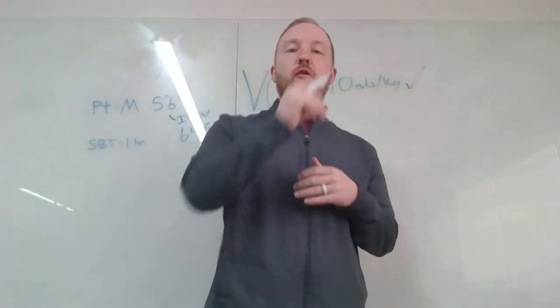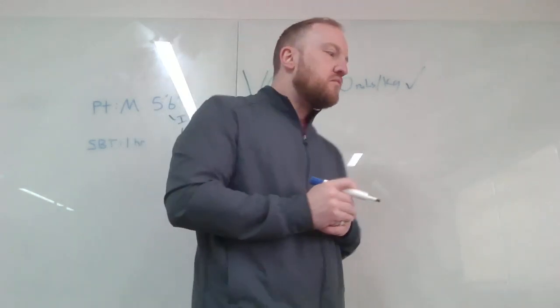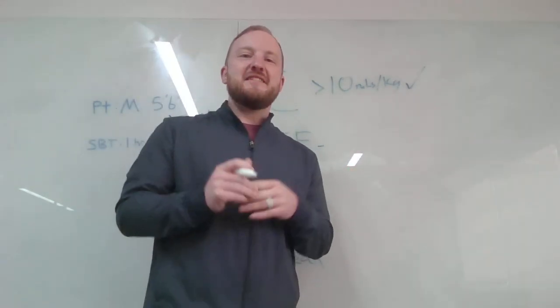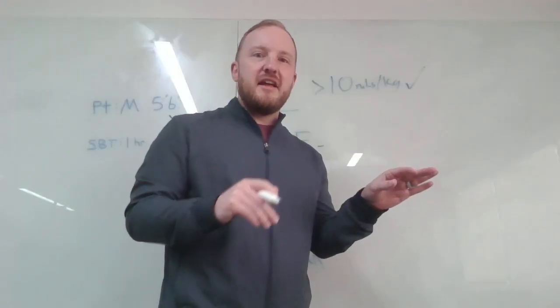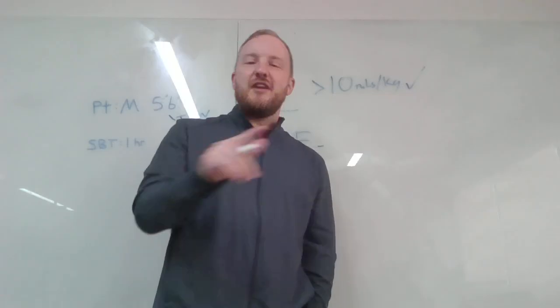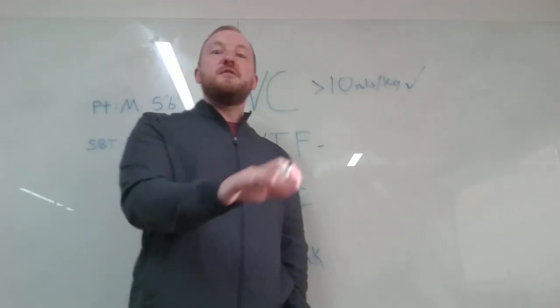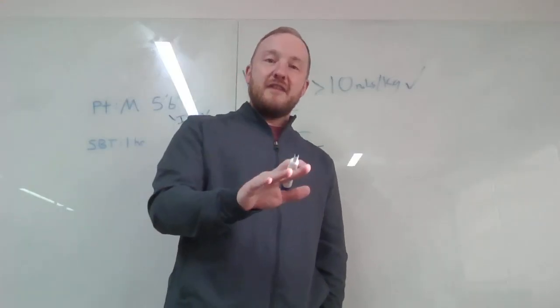So we want to make sure that before we pull that breathing tube out, you have adequate diaphragmatic strength. I always tell my students that when you're doing this test, they're going to be sucking against something, and they're not going to get air. So you want to tell your patients before you do this that you're not going to get air while you're doing this. After a few seconds, okay? But in the meantime, you're not going to get it.